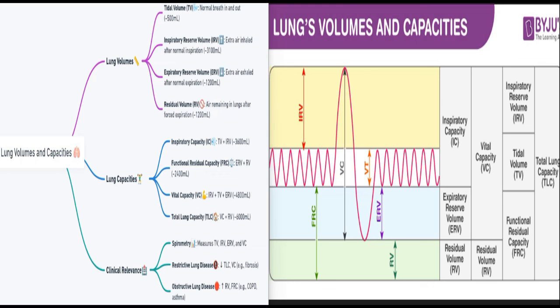When it comes to the use of spirometry in respiratory diagnostics, remember that in obstructive pulmonary disorders, or narrow airway tubes like bronchial asthma and COPD, the spirometric pattern is that the FEV1/FVC ratio is reduced, and FEV1 is reduced more than the FVC. With restrictive pulmonary disorders, with small lung volumes or total lung capacity from restricted lung capacity, the FVC is reduced more than the FEV1.